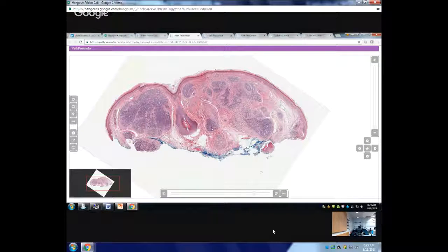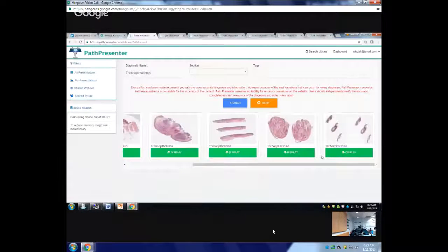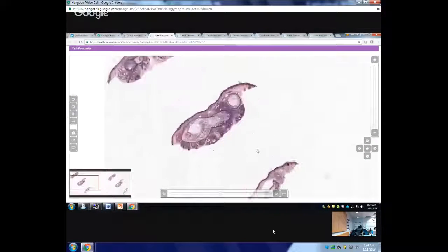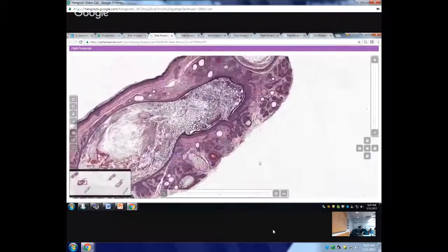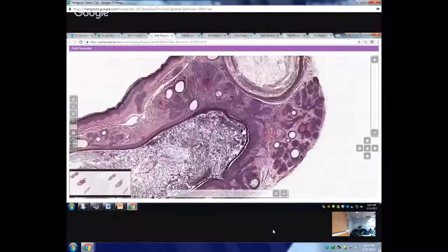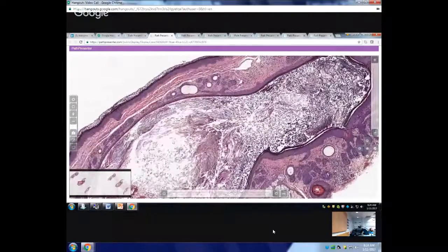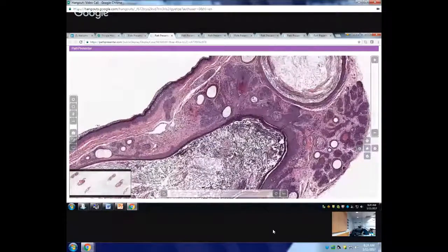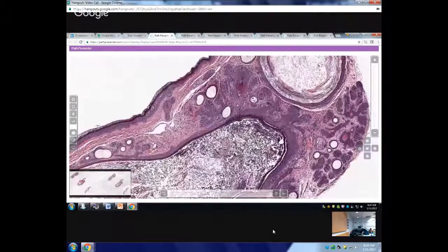In the trichoepithelioma, you want to see the papillary mesenchymal bodies and the keratocyst. This one doesn't have the keratocyst, but in other lesions you are going to see it. Let's find another one. This is another trichoepithelioma, the same one actually. This one has huge keratocysts in it. See, all these are keratocysts. The keratocyst is a classic finding in trichoepithelioma, or it can be found in any hair follicle.